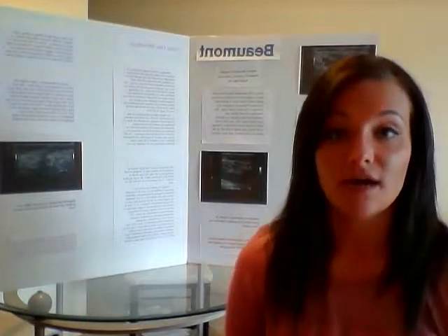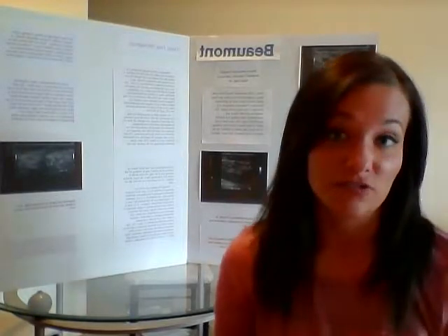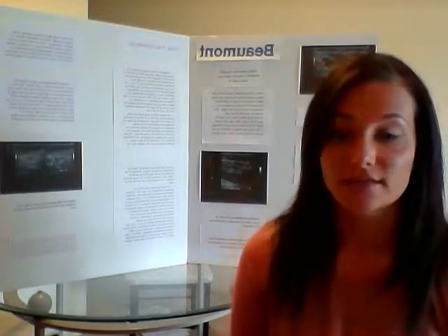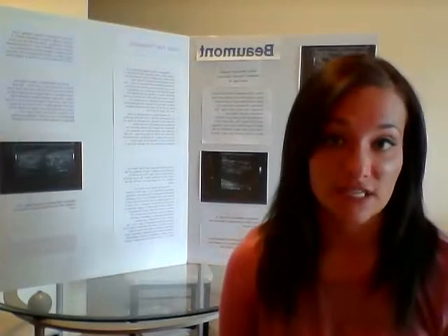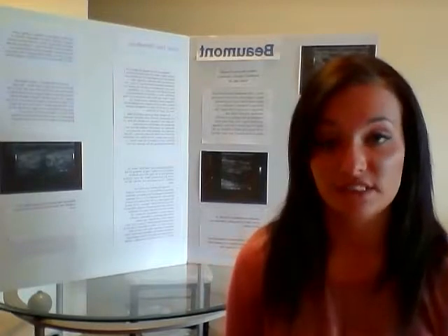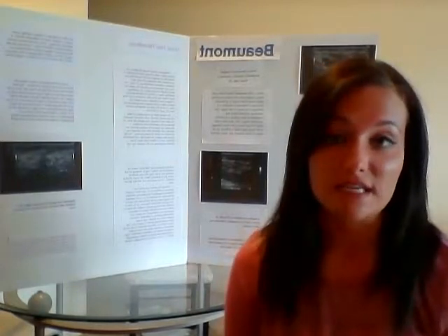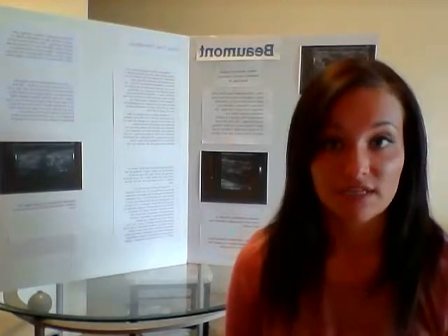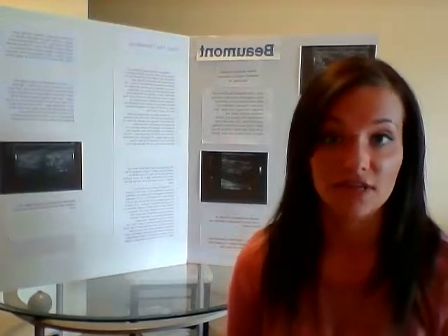And so I did the scan back in January, and I was kind of a new student, so I did the scan under the supervision of my technologist. As we went along, his right leg was negative for DVT and SVT, and his left leg was positive for DVT but negative for SVT. So he had DVT in the distal portion of the common femoral vein, the popliteal vein, the posterior tibial vein, the peroneal vein, and the soleal vein.